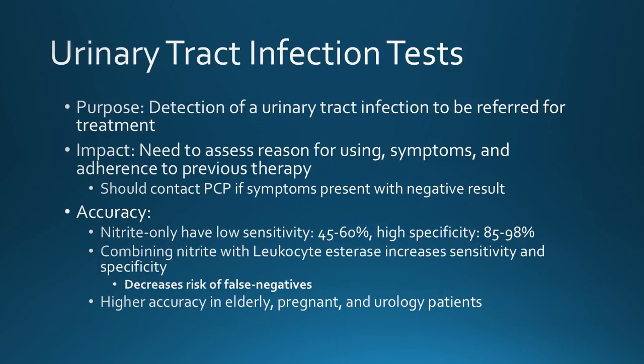The biggest issue with these UTI tests is that you're creating an additional step for the patient. Great, they found out they have a UTI that they most likely already knew based off their symptoms, and there are no antibiotics available OTC, so they're still going to have to go to their doctor to get appropriate therapy to treat the UTI. Accuracy can vary.